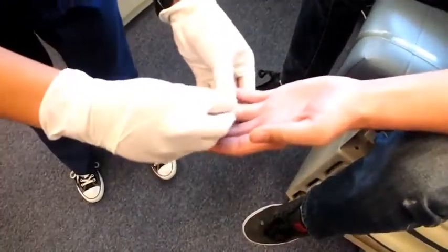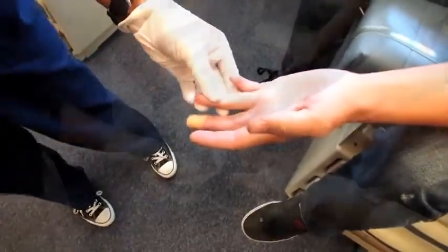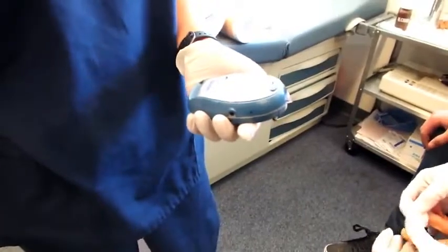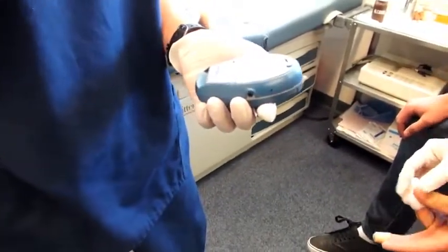For the first drop of blood. There you go. Oh, sorry. It's okay. All right, go ahead. Press it. Okay. 98.